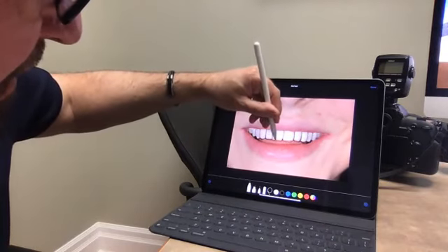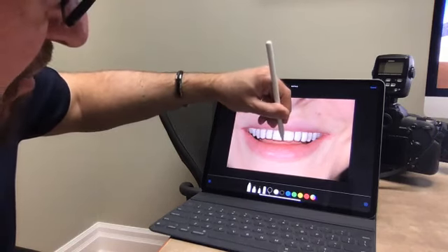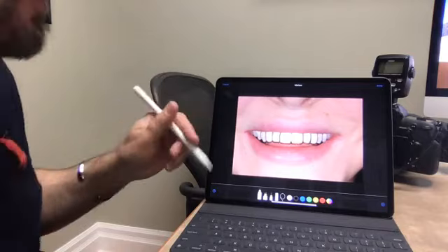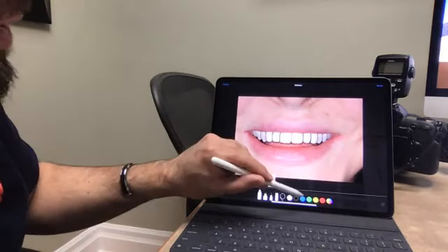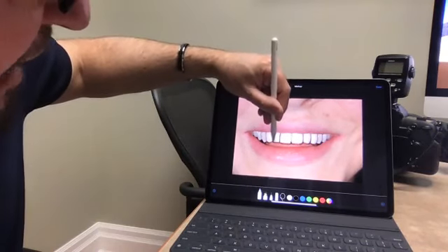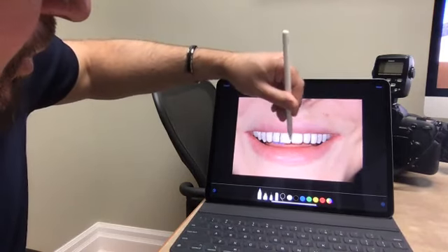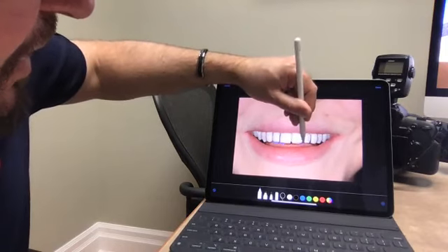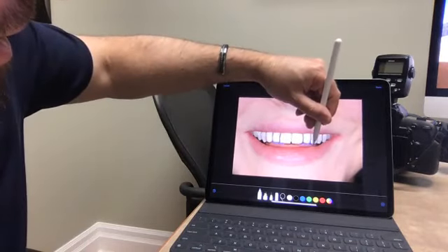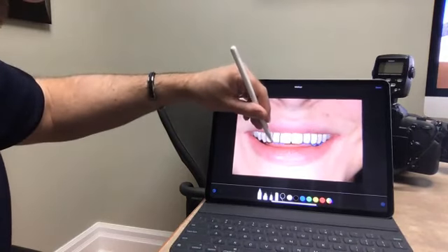They're a little square. So the other thing that I'd like to get from the patient, she came in with pretty square old composite veneers. We'd like to get an idea, do you like them square? Or would you like your teeth more rounded? So we could go to a blue and change them a little bit with the blue. Do you like this black, or do you want to see maybe a little bit more rounding of the teeth, more like the blue here? And we could have even an interactive discussion, changing the tooth shape a little bit with the blue and the black lines to find the place where she would like them.